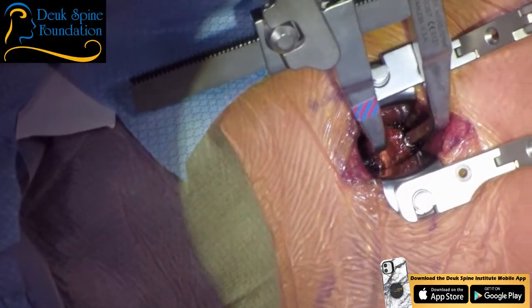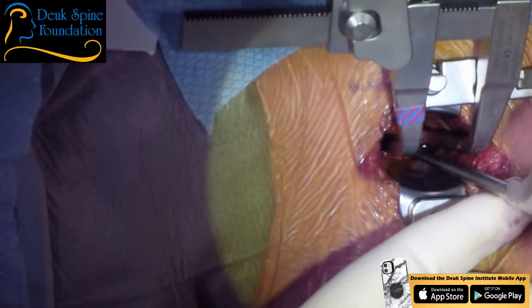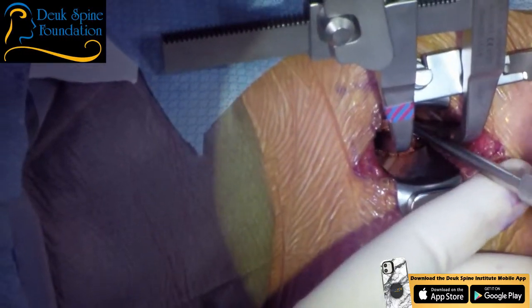You should always be able to see your instrument tip. Never go blindly anywhere. This is a 5? That's a 5. Good. Yeah, it's a nice disc space, and we got good distraction.